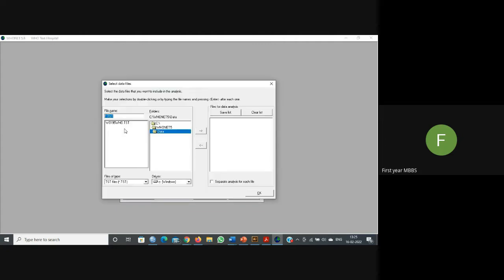From which data file you want to see this? So you may have monthly data files. You can see it in the different months, or you can combine all the files. Okay, you have the option of combining all the files. So I want to see January, February, and March. I can combine all these three files under a single file that I can select.